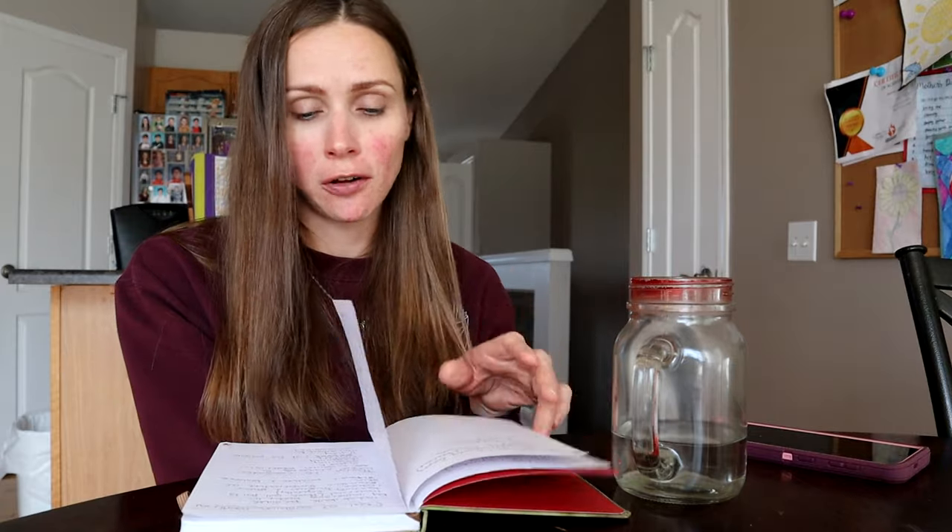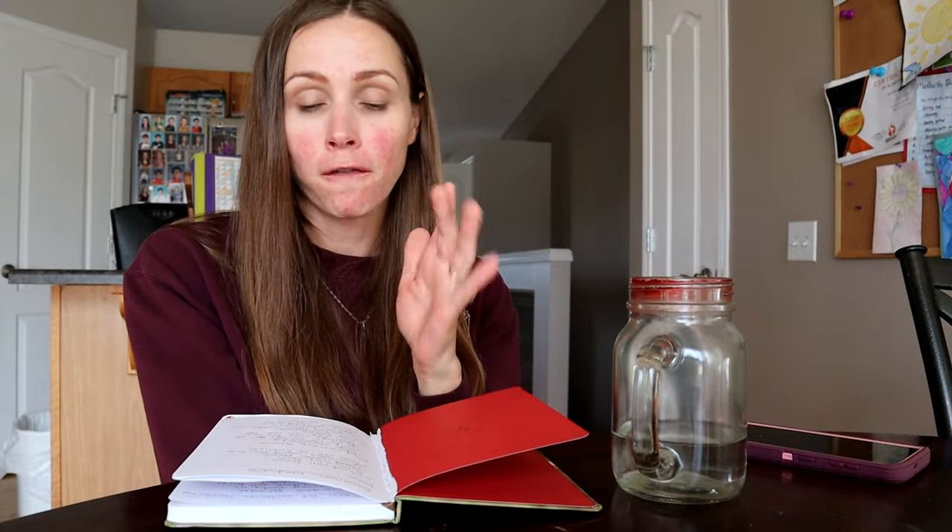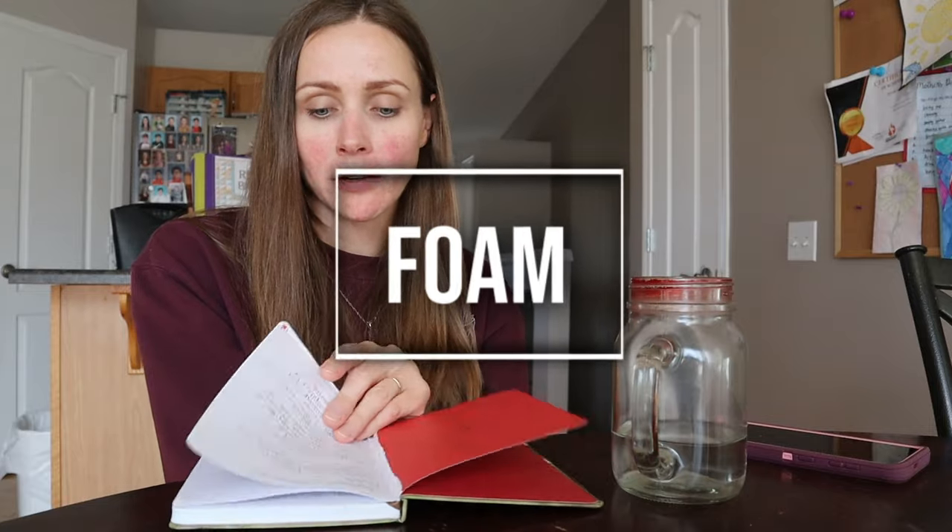Now we'll get into the actual cushion materials, starting with foam. Before we talk about the different types of foam, I want to cover some terms: responsiveness, resiliency, density, firmness, closed cell, and open cell. Closed cell foam is exactly what it sounds like — the foam cells are closed. Picture small balloons all crowded together. Open cell foam has cells that are open and connected, kind of like a matrix of branches supporting one another.